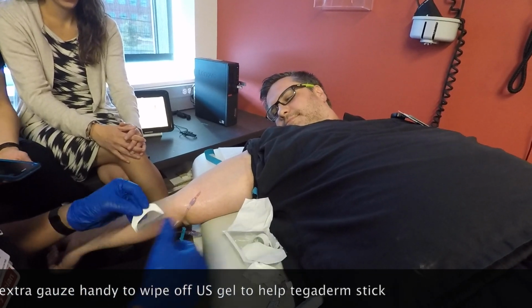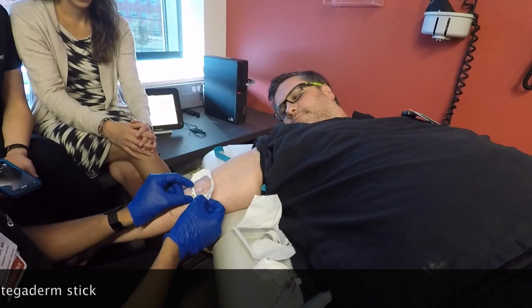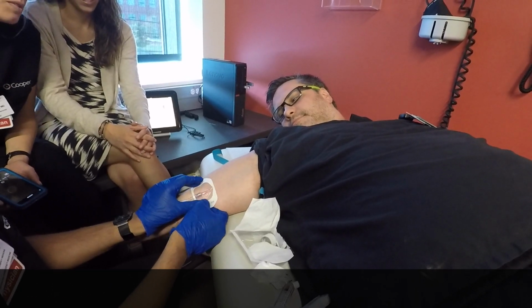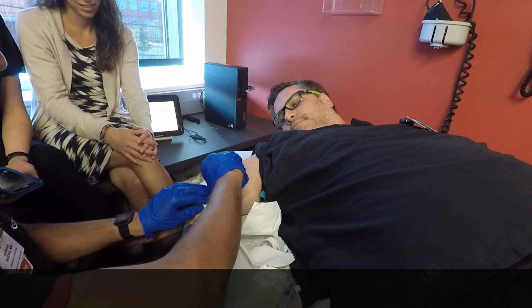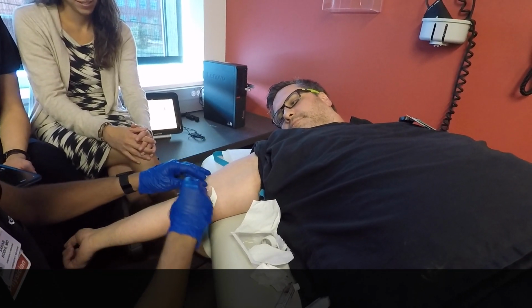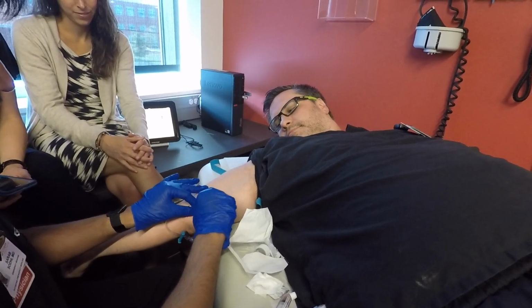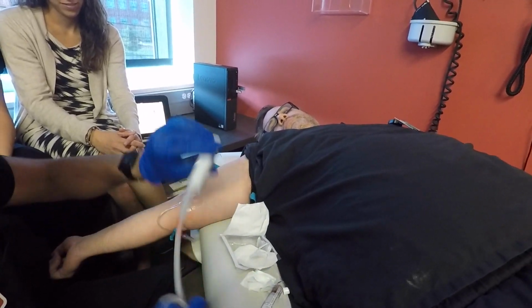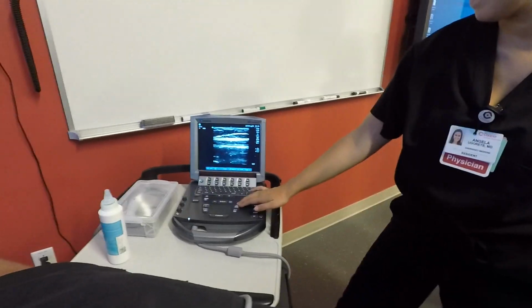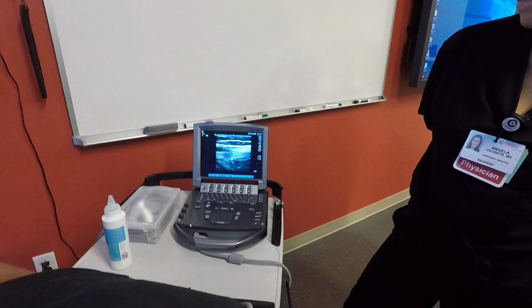Oh, that's a good point. Thank you for asking, Dr. Walinchus. So typically I will try to make sure we put the tegaderm right over, secure it with the entire assembly covered up, right? So we clean that entire area before we start it, secure it down this way, and then once you take this off, I'm a little aggressive with tape, so I will put at least 3 to 4 strips across, most importantly right there. Now remember, you can look with ultrasound and see that there is at least 3, maybe 4 centimeters of catheter in there. So it's unlikely that this is going to go anywhere because there's just so much catheter available.